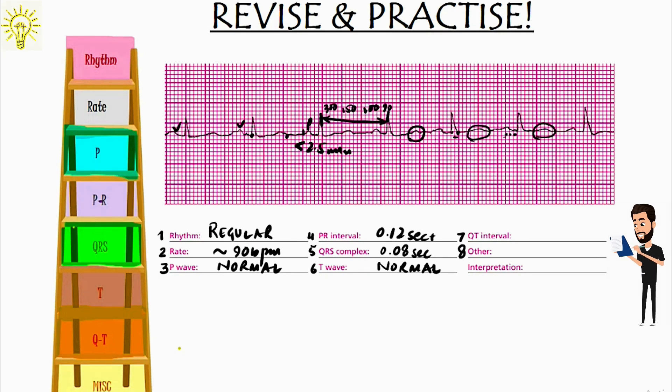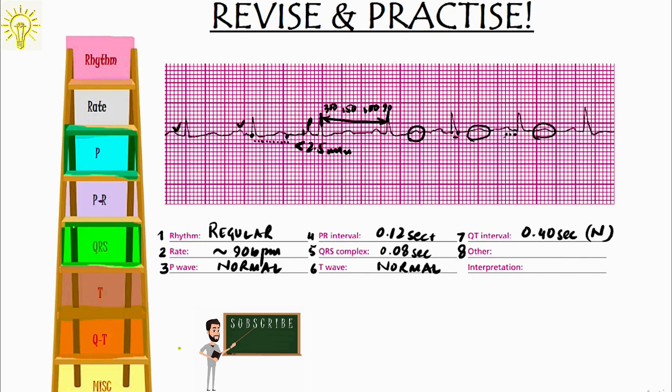For QT interval, there are around 1, 2, 3, 4, 5, 6, 7, 8, 9, 10 small boxes, which makes up around 0.4 seconds. So, that is normal as well. There is no other anomaly that I can see in this ECG. So, I declare it as normal sinus rhythm.